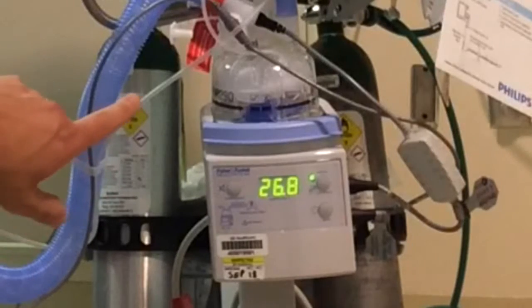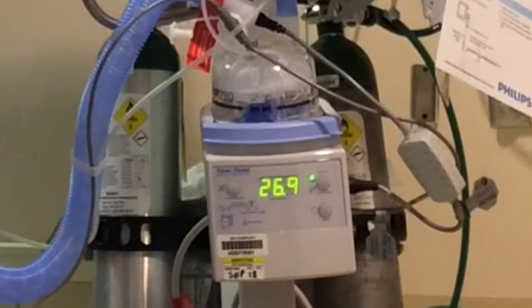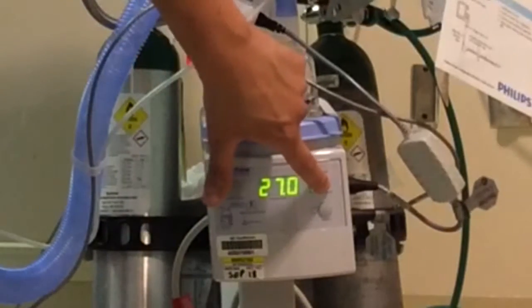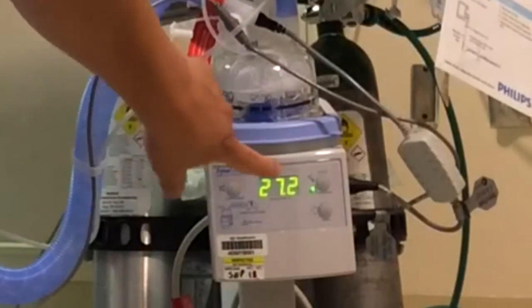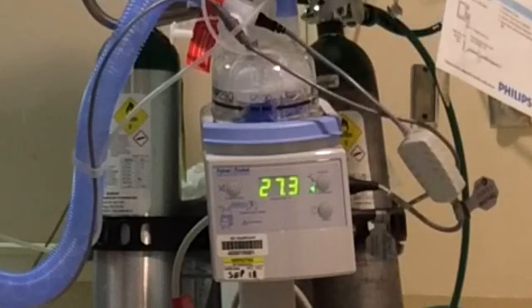It's automatically defaulted up here to the invasive mode, which is going to put on a lot of heat. So what I do is you just touch that top right one, hold it in until you hear the beeping again, and it will signify at the bottom there that it's on the non-invasive side. And that's how you run your heater.